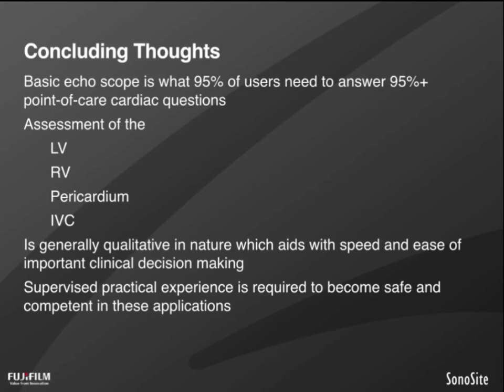A qualitative approach is really what we need. Quantitative, calipers, Simpson's biplane method of disc, time-consuming, and cognitively overloading. Simplify your assessments using an eyeball approach, and you'll be happiest. Lastly, you must have supervised practical experience in order to become safe and competent in using these applications. You can certainly self-teach to some degree. However, without quality assurance and oversight and people to bounce your studies off of, you can't reliably become competent.